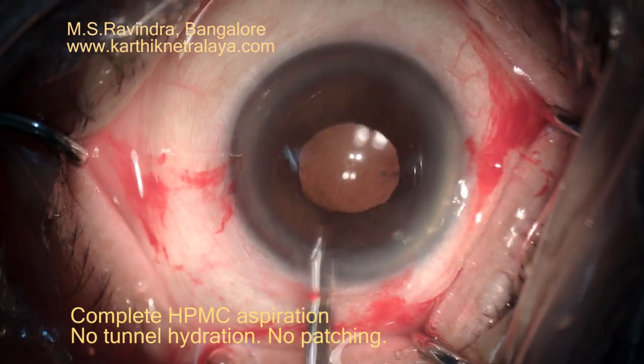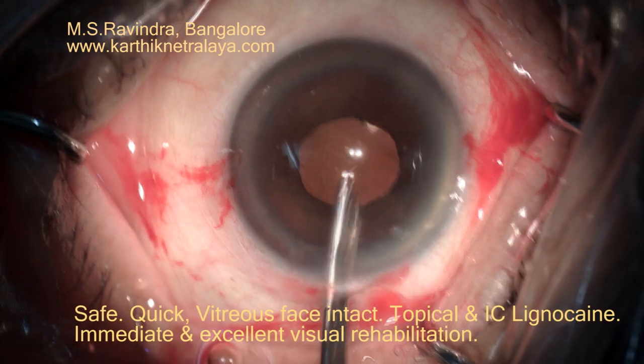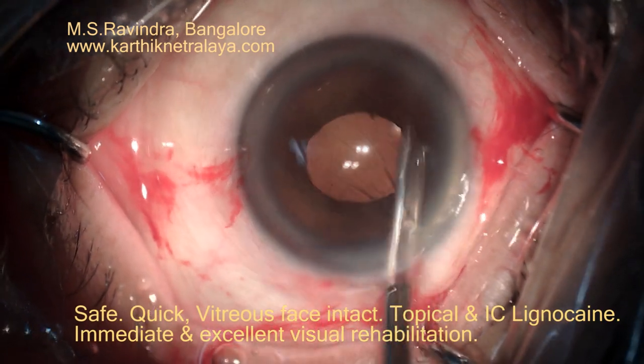This technique gives excellent visual results. There is no need to bandage the eye. Rehabilitation starts immediately. Thank you.